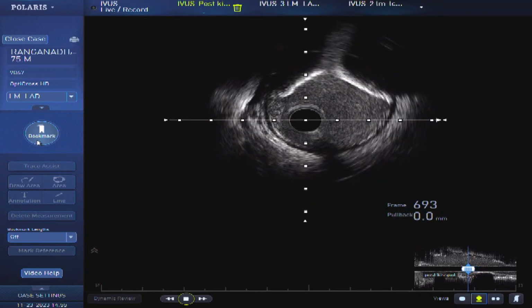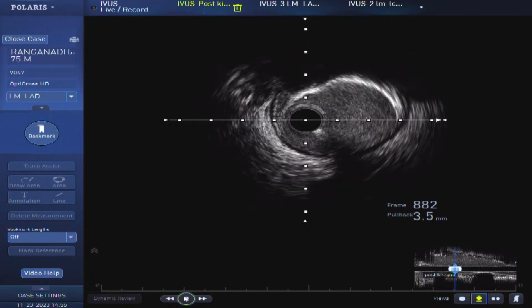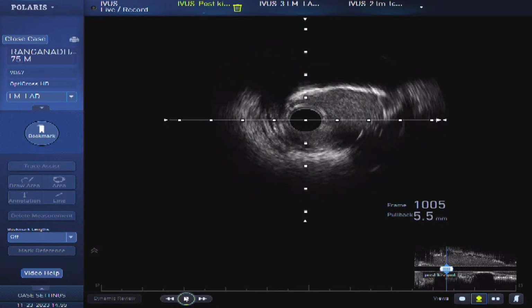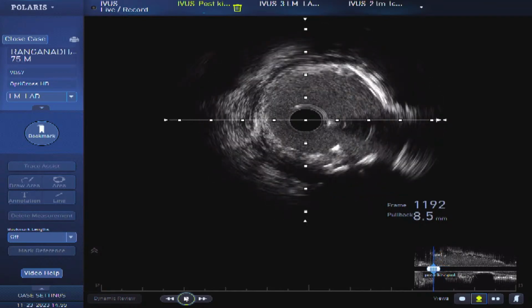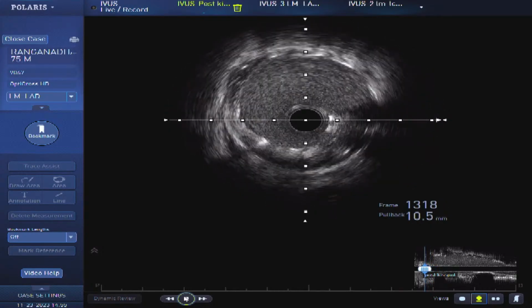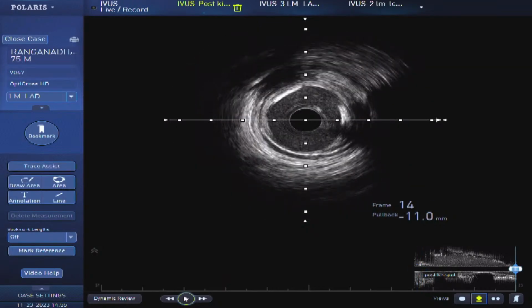Now we see the LAD osteum. Now we are coming to the osteum. It's nicely expanded compared to earlier. So we did a minimal balloon extension into the proximal LAD and dilated to see that struts are separated and the osteal LAD area is good. Now see the left main, nicely apposed, no malapposition and very good MSA. Very good MSA. LCX వేస్తారా?